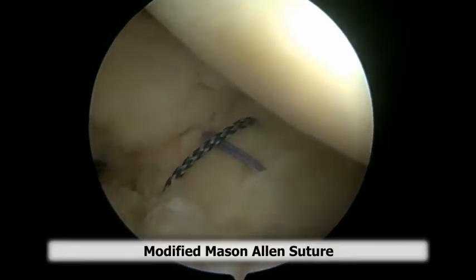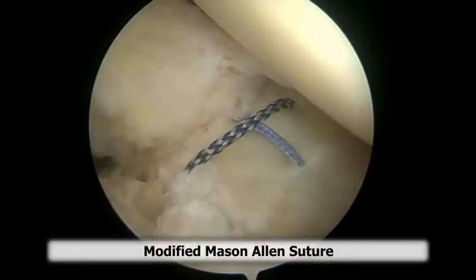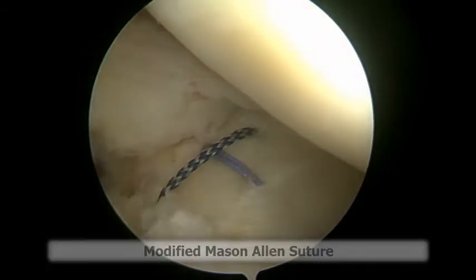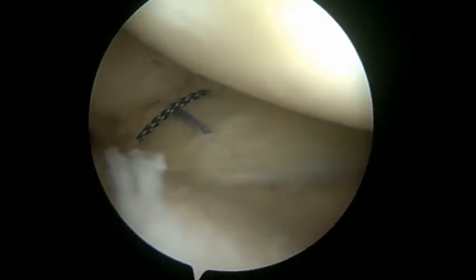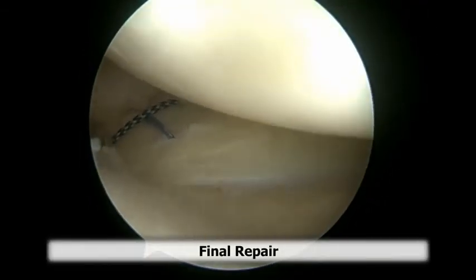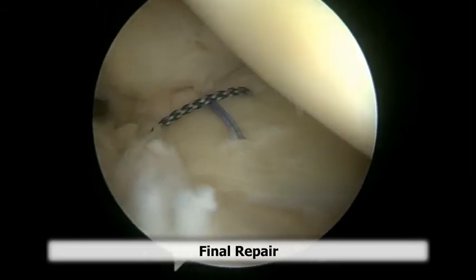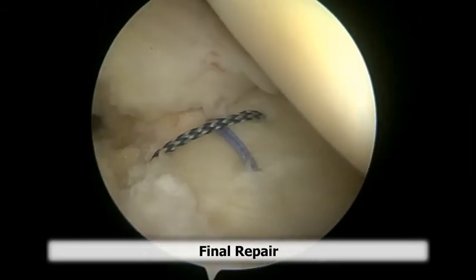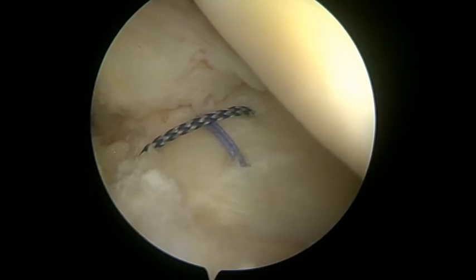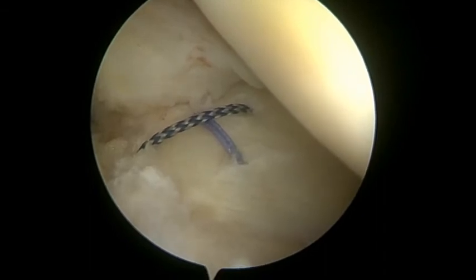The sutures will then be tied over the anterior surface of the tibia. Here you can see our final repair. This is a modified Mason-Allen type suture, and it is important to see nice compression of the medial meniscus into the repair site as shown in the video.